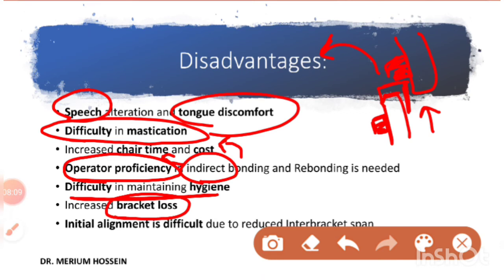Okay, now the initial alignment is going to be very difficult in this case, because the interbracket span is entirely reduced when you apply the brackets lingually, as compared to when you apply them onto the labial surface. Now I'll explain this to you guys with the help of a diagram.